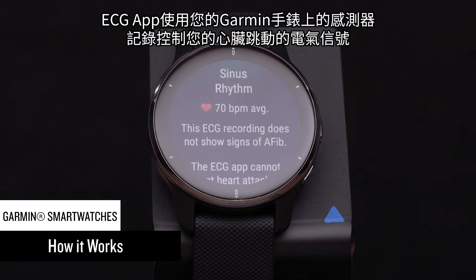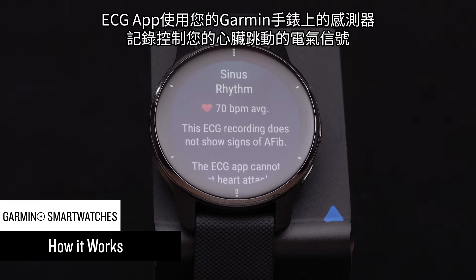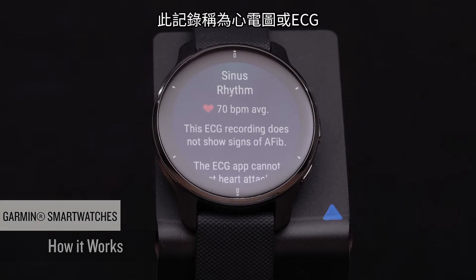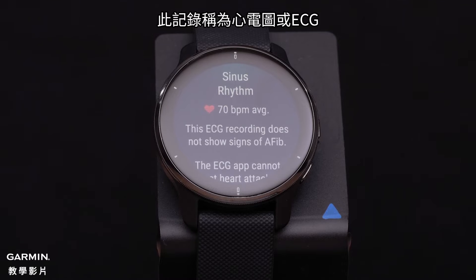The ECG app uses sensors on your device to record the electrical signals that control how your heart beats. This recording is known as an electrocardiogram, or ECG.